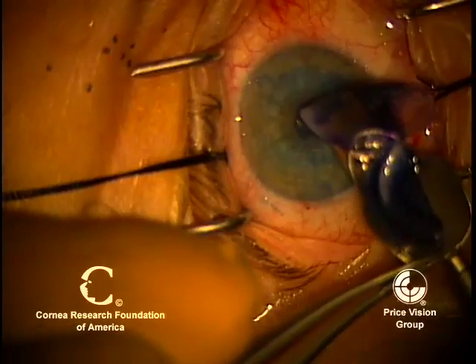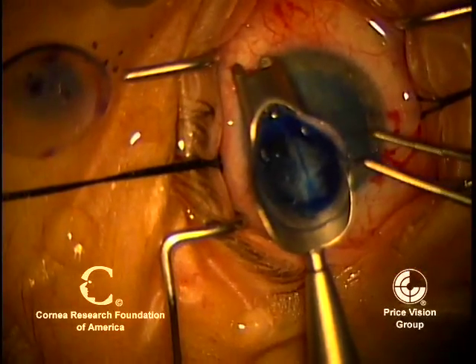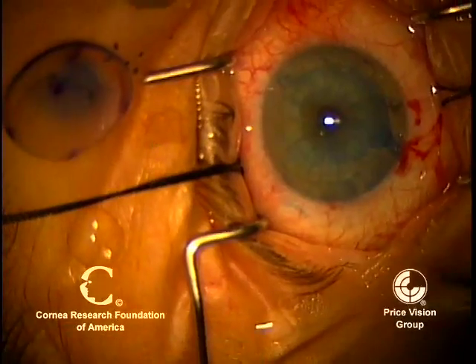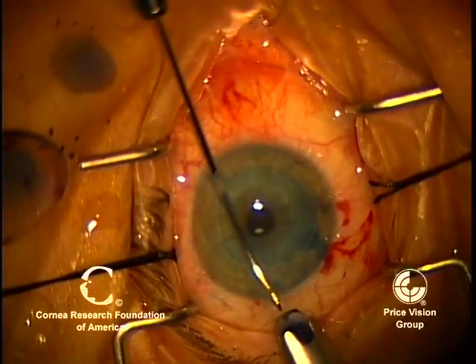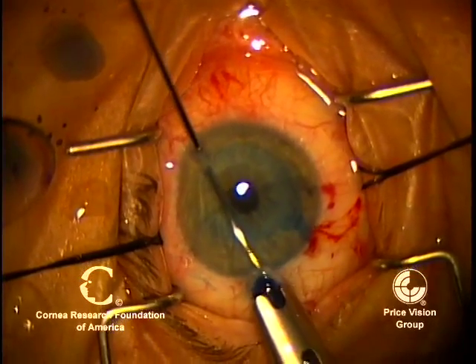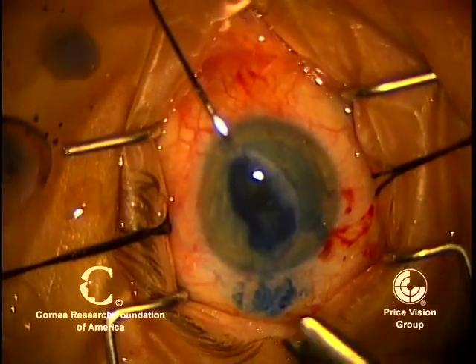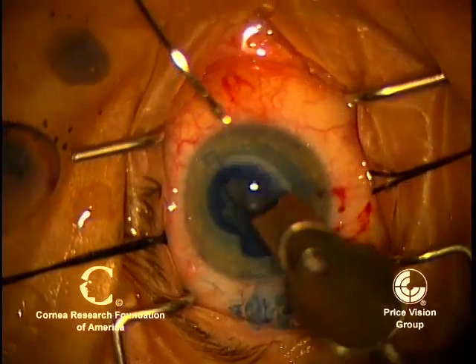Here we're going to load the donor onto the Busin glide. These donors are much thinner than the standard DSEK donor because there's no central stroma, so it's a little bit more flimsy. The Busin glide helps curl it so that when it goes into the incision — this is a 3.2 mm keratome incision — it's curled appropriately so that the endothelium is inward. You can see how easily this unfolds once it goes into the eye.